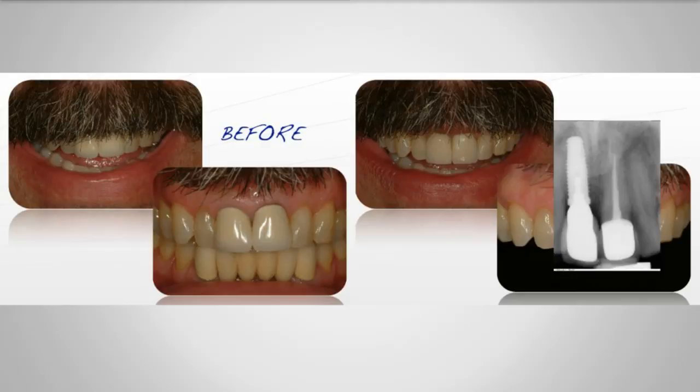Here's the radiograph, the platform switched implant. Of course, the zirconia is going to be radio-opaque, and here's the baked porcelain over that. And here is the zirconia core crown on the adjacent central incisor. As you can see, we preserve that interseptal bone very nicely, which gives us the papilla form.